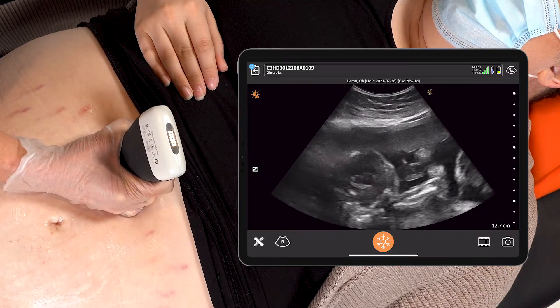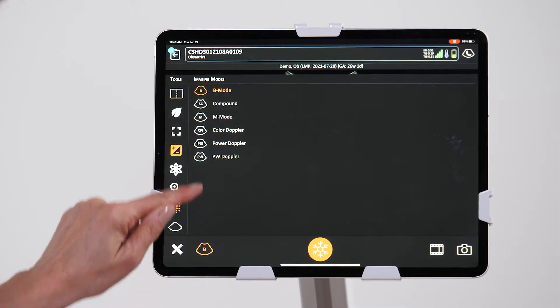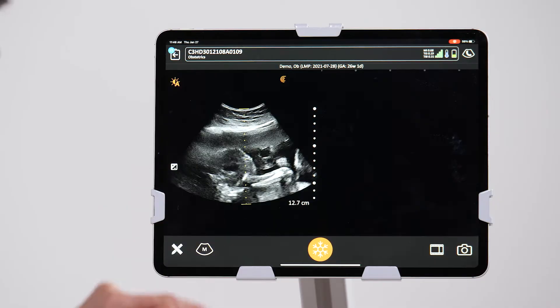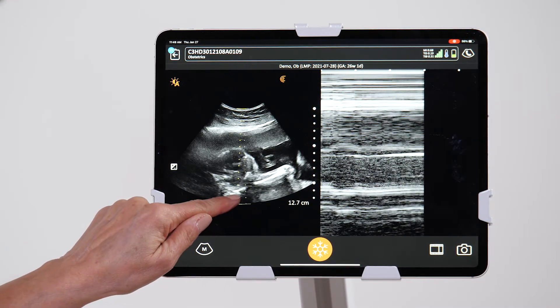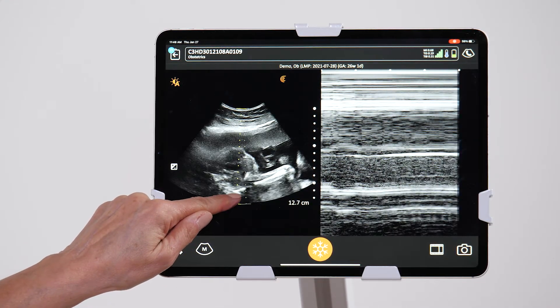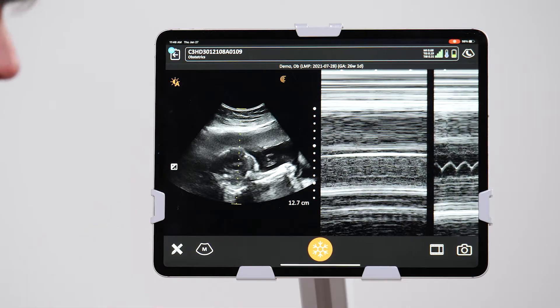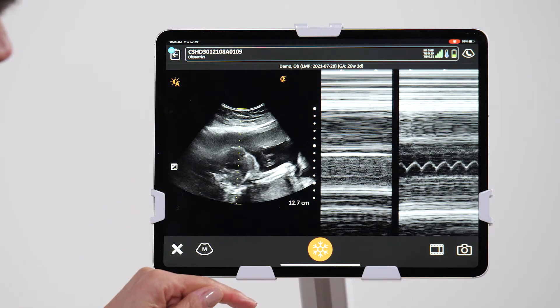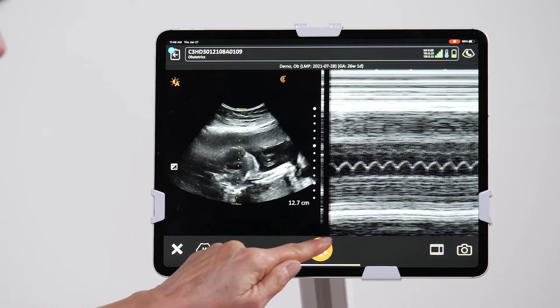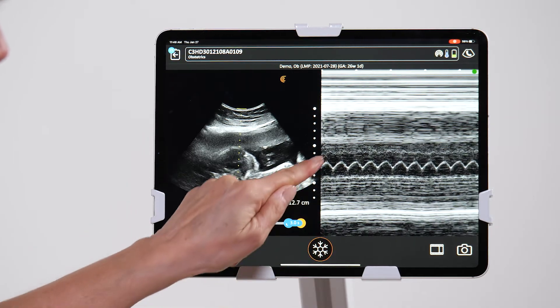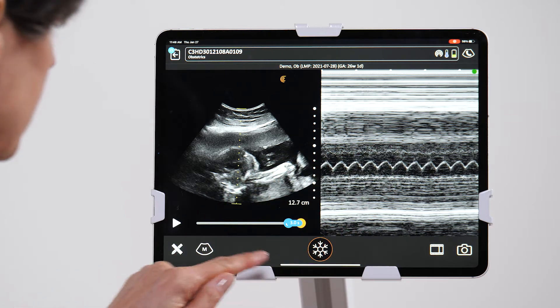From here, I'm going to go into the mode settings and select M mode. We want to place this line over one of the moving structures, and in this case it's a valve. And we're just going to watch the M mode until we get a nice tracing of that motion.